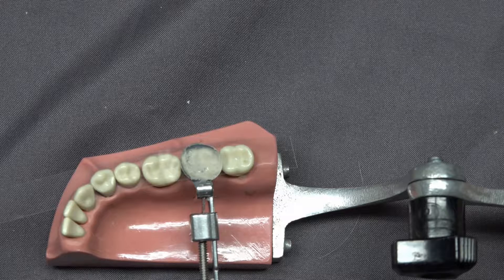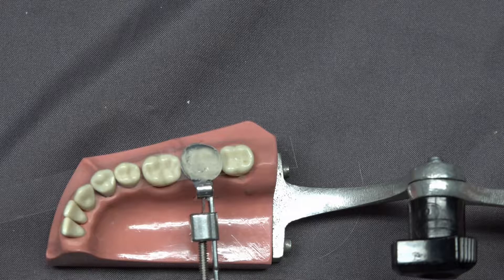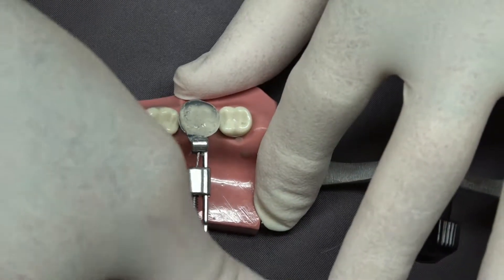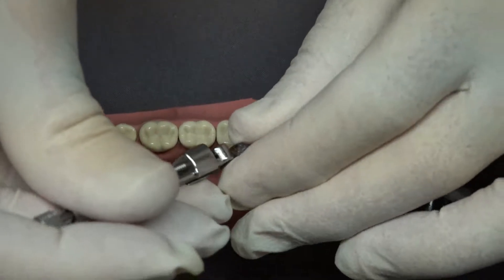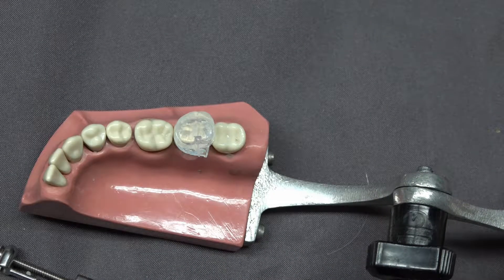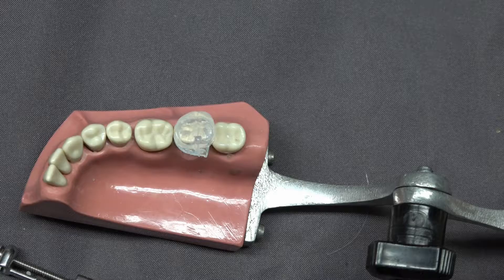It takes about 45 seconds for this to set in the mouth; outside of the mouth it's going to take a little bit longer. The Mylar strip comes right off, and the matrix band comes right off. Right here is a clear custom matrix that we will use later on, allowing us to mold the composite to the exact shape of the occlusal anatomy and shine light through it, curing in the original anatomy without any composite finishing or polishing.